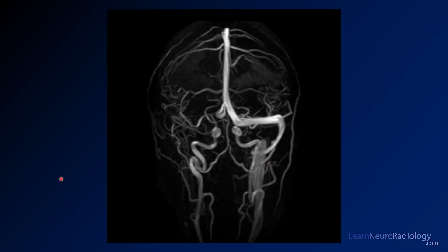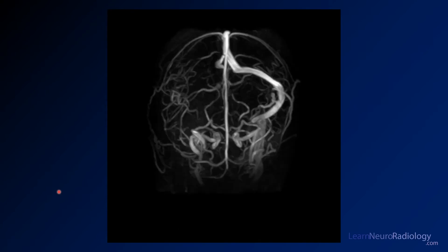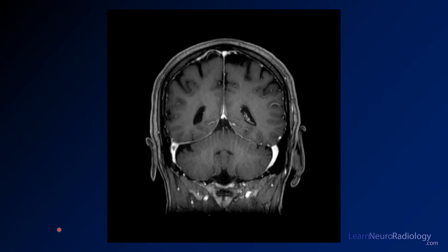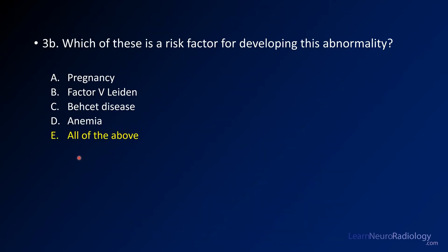Just a couple more images here. You can see the venous drainage is completely absent. On the post-contrast images, you have a delta sign — a filling defect in the right transverse-sigmoid sinuses.